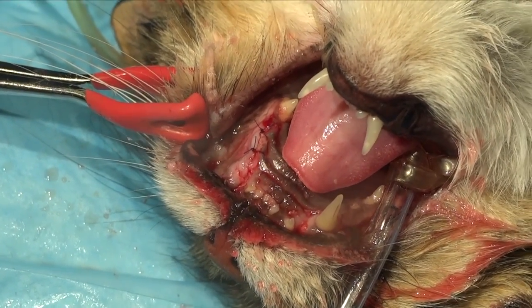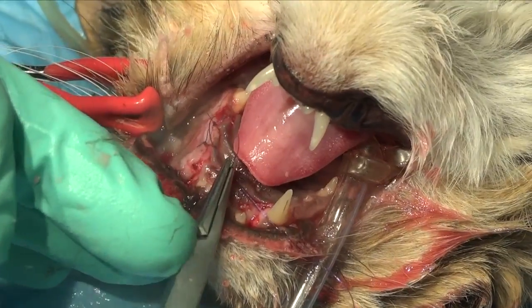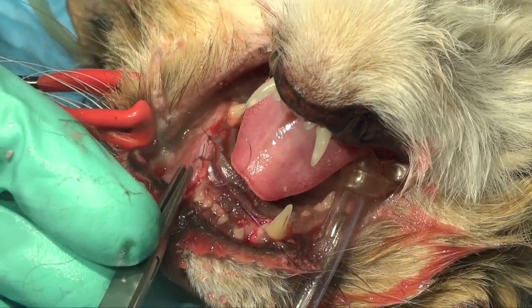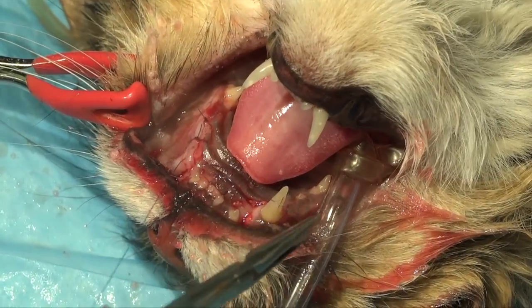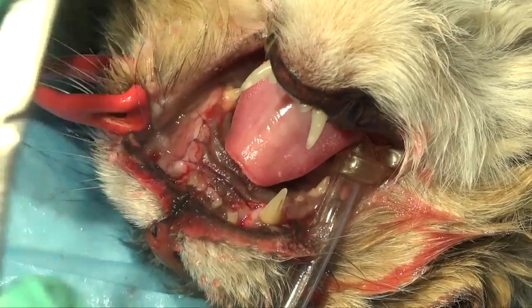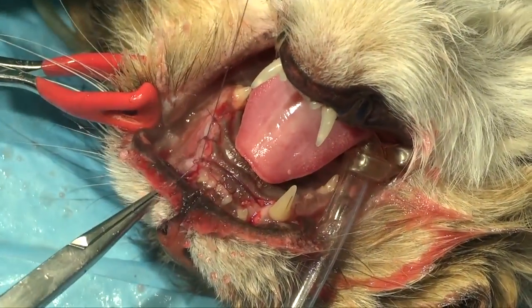Had we seen that the tooth interface was more apical to where we did our excision, we would definitely want to go up as far apically as we need to to remove the tooth structure, leaving just the bone. If we had a periodontal ligament space that we could see around that tooth root, then we would treat it exactly as we would in a regular extraction and extract the entire tooth root.